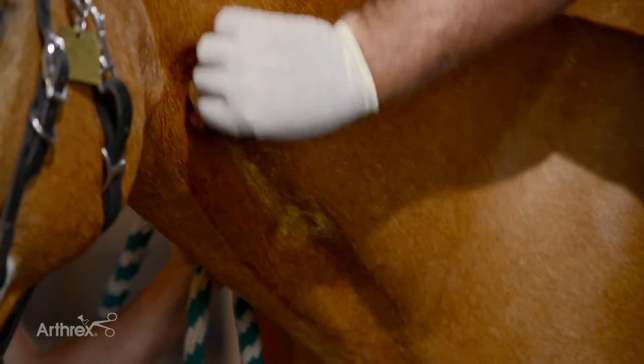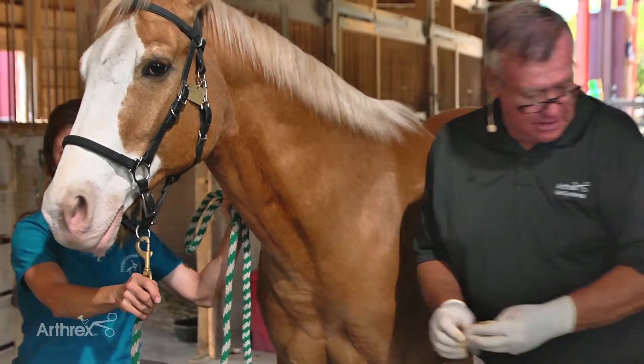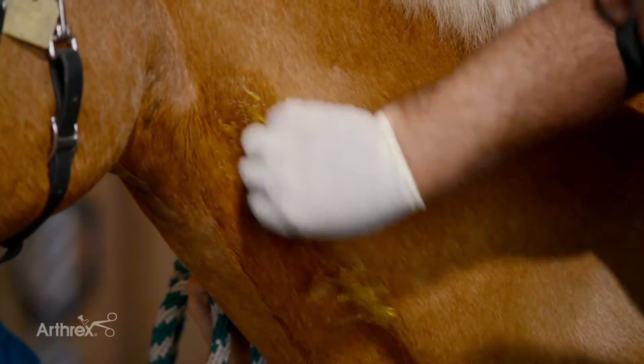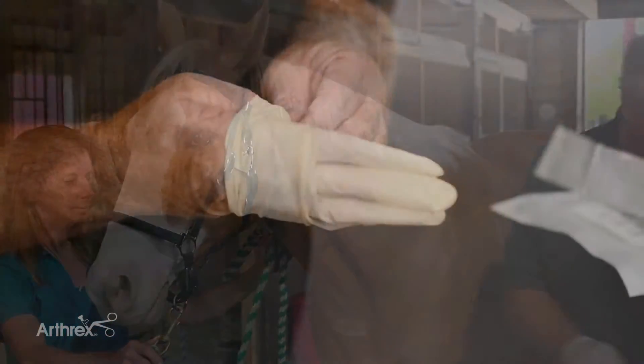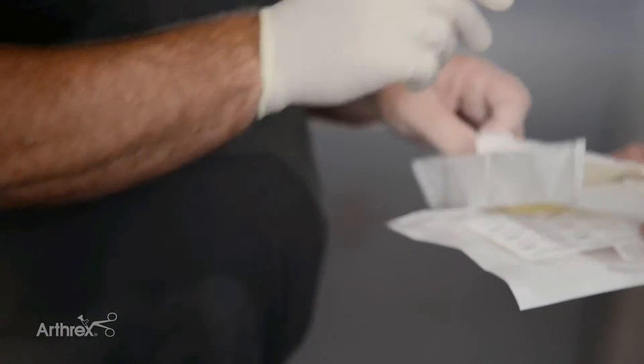In preparation for the ACP we like to clean the jugular area as well as we can. We do it at least three times with betadine and alcohol, because it is a blood product we want to be as clean as possible at all times and at all places of harvest and preparation. After preparing the jugular, I go ahead and put sterile gloves on for harvesting the blood.